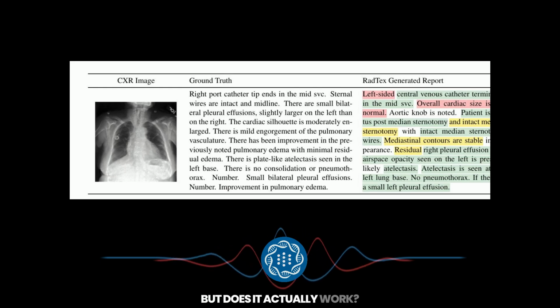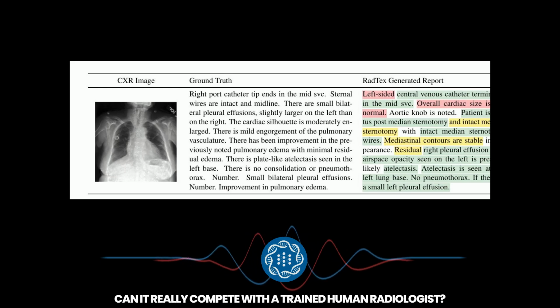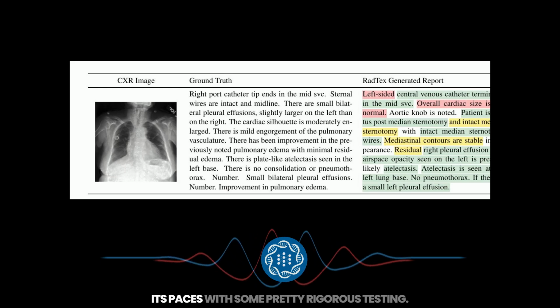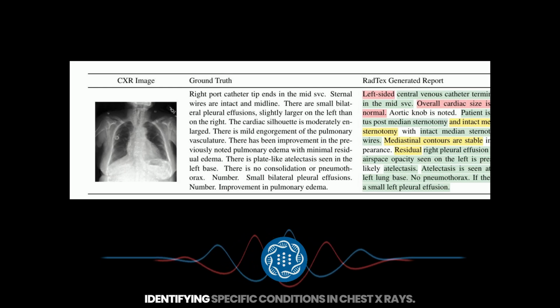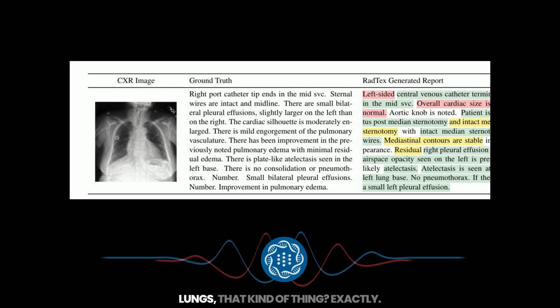But does it actually work? Can it really compete with a trained human radiologist? That's the million-dollar question. The researchers put RadTex through its paces with some pretty rigorous testing. They wanted to see how it would perform on a variety of tasks, like identifying specific conditions in chest x-rays. Like pneumonia, collapsed lungs, that kind of thing.